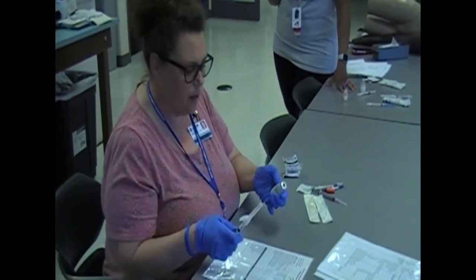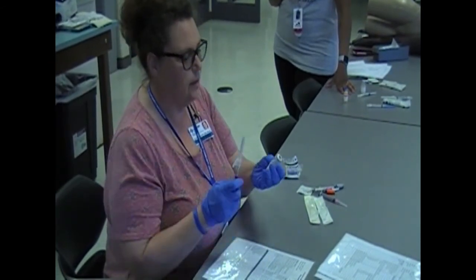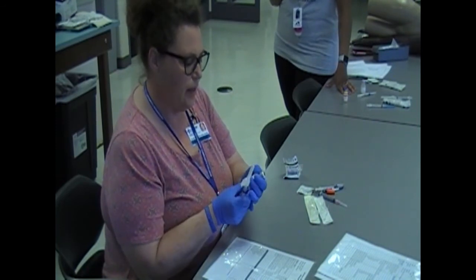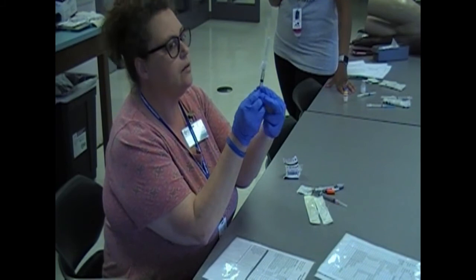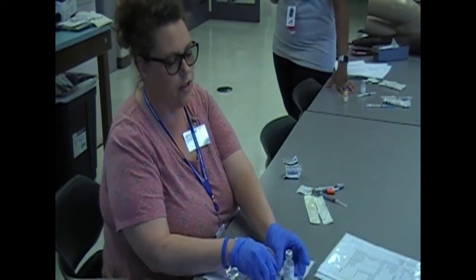So here's my ondansetron, 4 milligrams, IM. Here's my ondansetron, and it's 4 milligrams per 1 ml, and my expiration date is good. And I'm going to make sure that I have 1 ml and I have no bubbles, and then it's good to go.